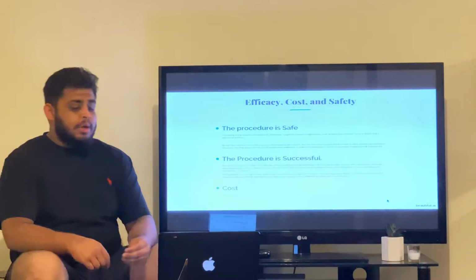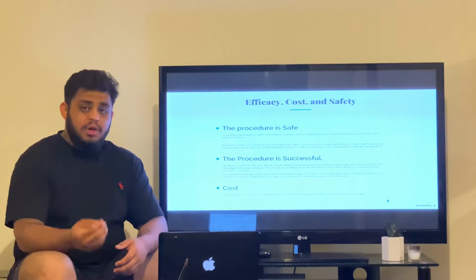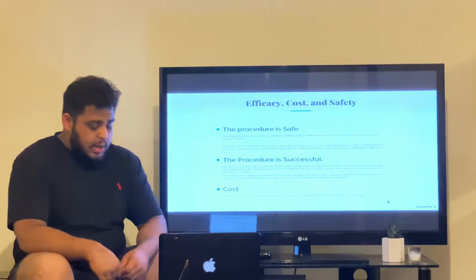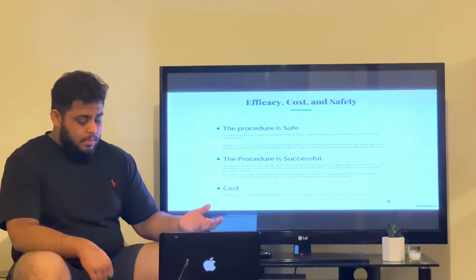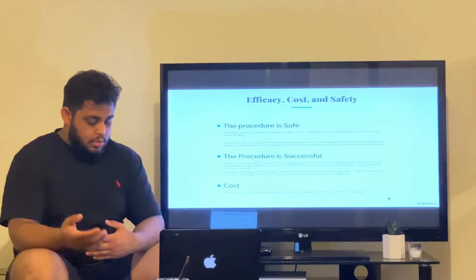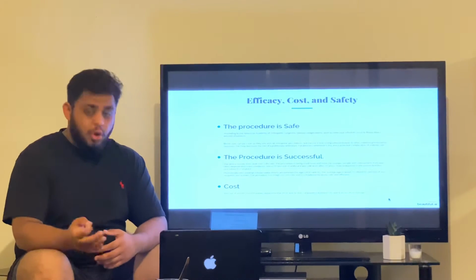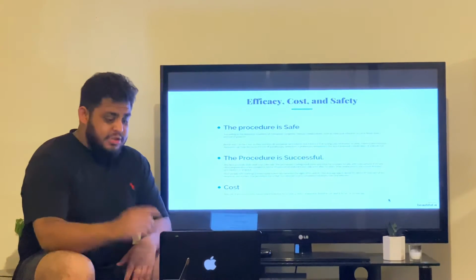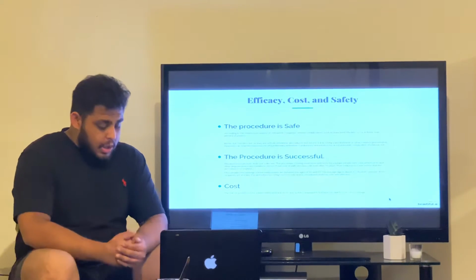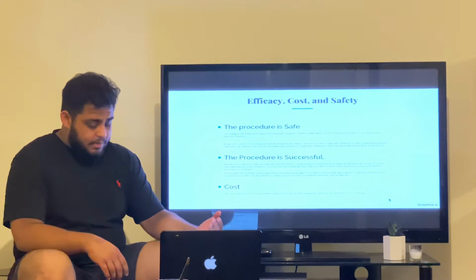Now I'll be talking to you about the cost and the safety of this procedure. This is a safe procedure as joint infections only occur in fewer than 2% of patients. Blood clots can also be a problem, which is normally common in all orthopedic procedures, but blood thinners are used to overcome this issue. Now, this procedure has a high success rate. Lots of these knee prostheses last well over a decade.